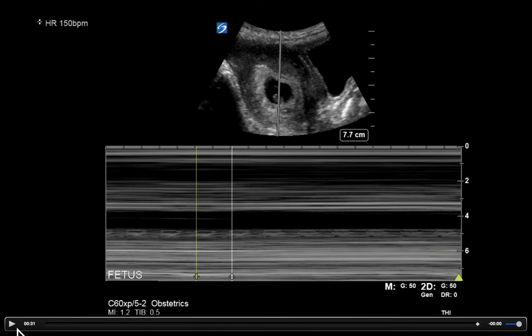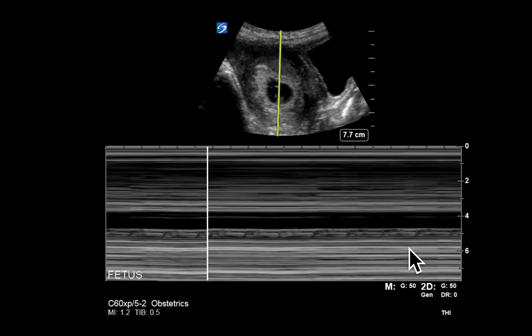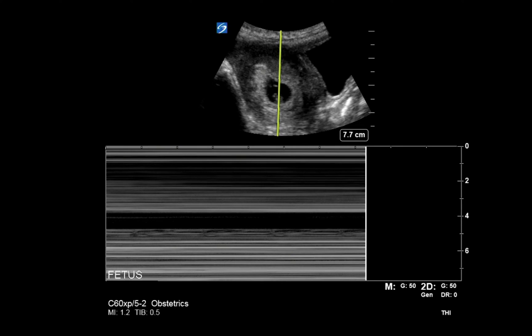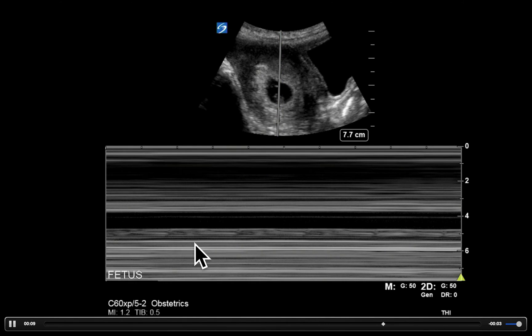Now there are some pitfalls I'm going to show you. On M-mode we get a tracing, but there is something called sweep speed — that's how fast it goes from one side to the other. If the sweep speed is too high, it's not going to give us a nice pretty tracing. We see these peaks or complexes that look the same, but when the speed is too fast it's just too difficult to see and measure.